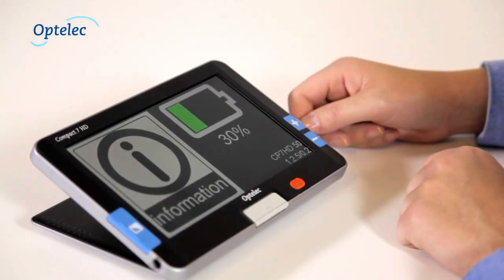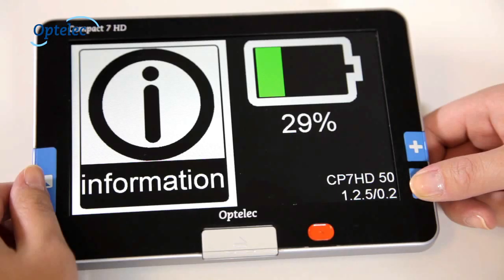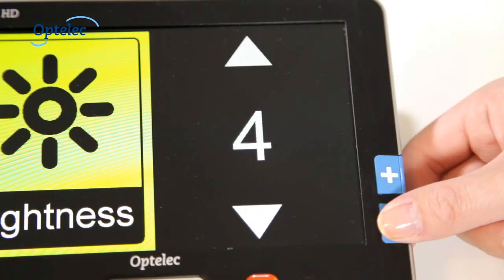This also allows you to view the battery level. Press the plus and minus buttons to browse through the menu. The mode button allows you to confirm your selection.